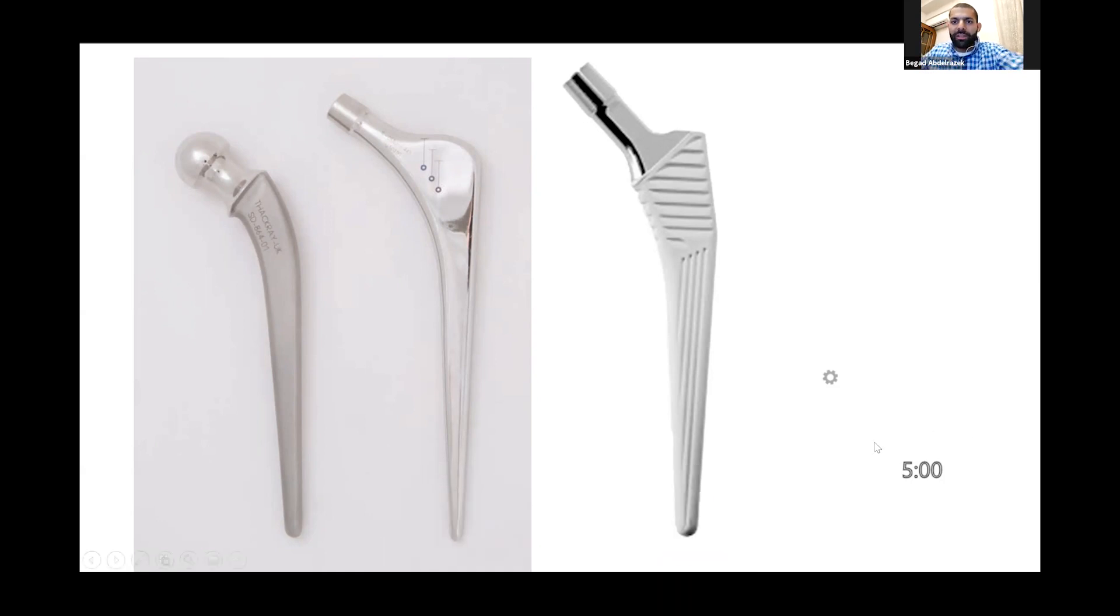Hi again, hi Waleed. This is another viva scenario regarding the different stem designs used in total hip replacements. Waleed, can you have a look at the picture and tell me what you think? What are these? Yeah, these are three different stems. The one to the right is an uncemented stem, then the two to the left are cemented stems.